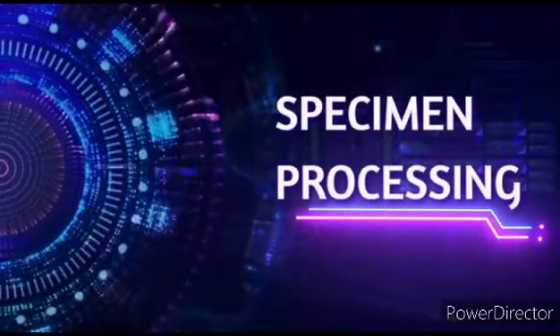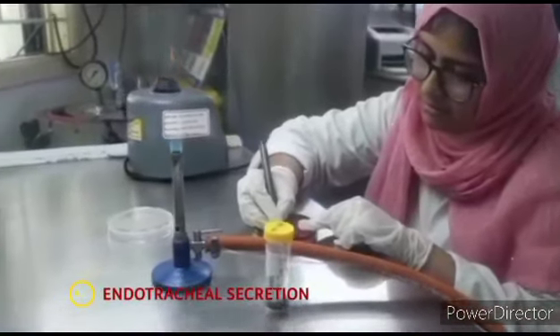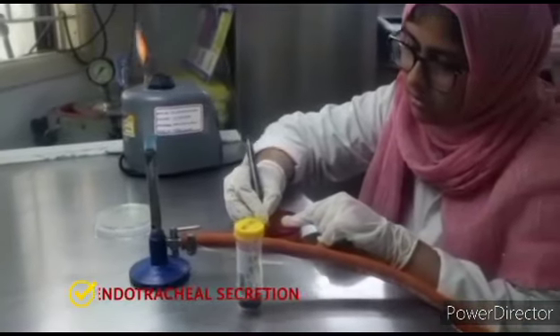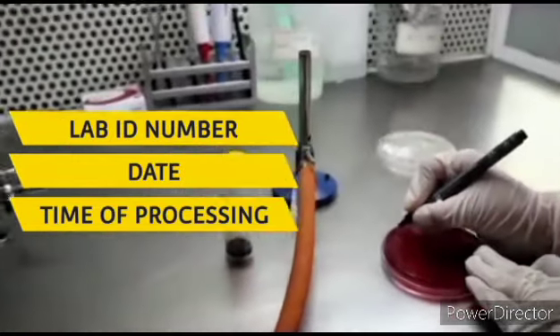In the clinical laboratory, the basic process starts with specimen processing. Here is the endotracheal sample that has been taken by endotracheal aspiration. First, the plate was marked with the lab ID number, which is used to trace the sample until reporting. Moreover, the date and time of processing is noted, which is used to analyze the colony growth rate.